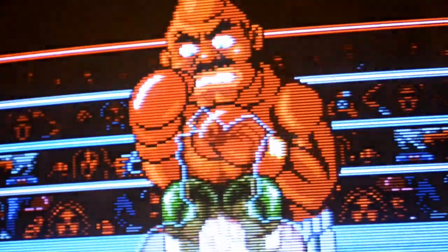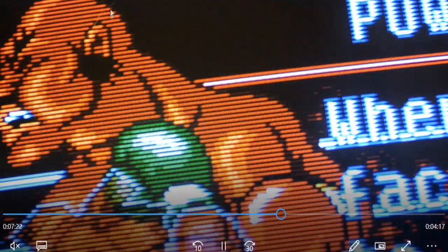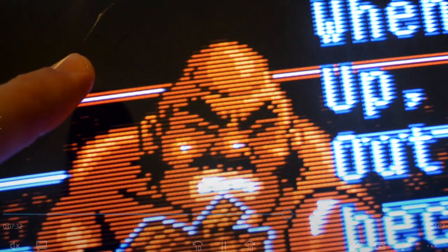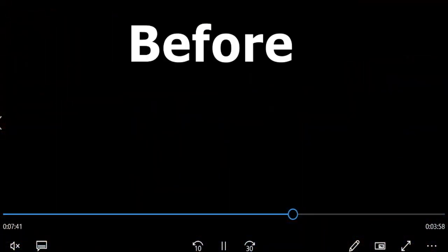This is, again, after the fact, but I want to show you up here next to Bald Bull's head. I'm going to circle it with my cursor. There's a scratch on the screen, like a hairline scratch. It really shows up well on this picture. You'll see in a second, I'm going to use my finger and rub it. But that scratch is on this screen. So, unfortunately, that's stuck in this layer of glass and is not really removable.